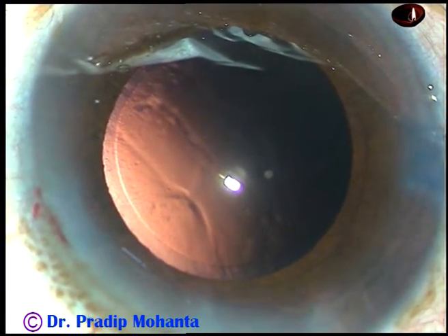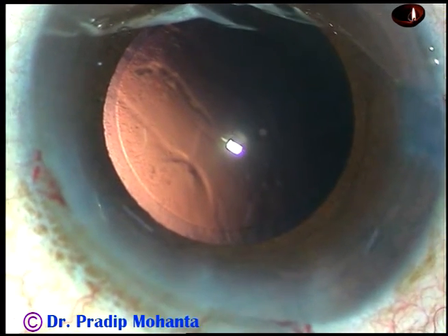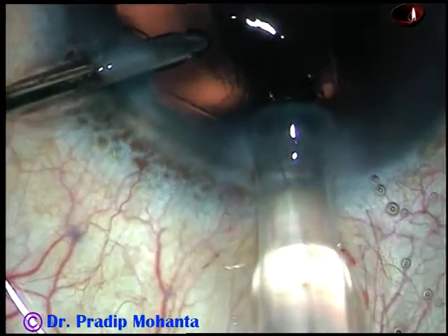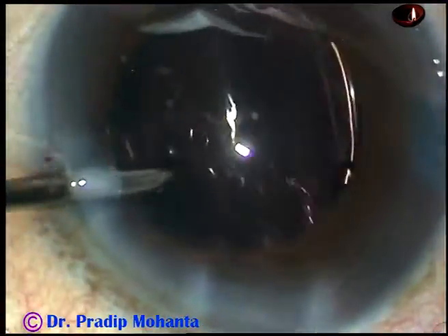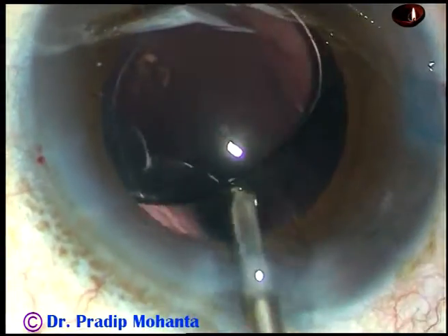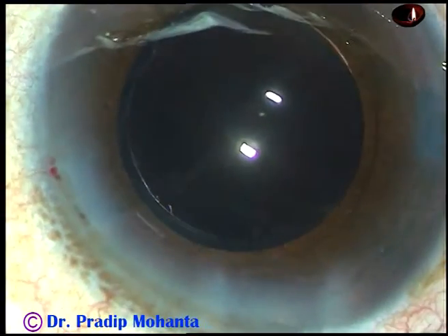And now in this case we have selected a hydrophilic acrylic intraocular lens because the patient belongs to a poor socioeconomic group. Here is the lens. And now the lens is dialed by the irrigating probe itself. Whatever viscoelastic was there in the lumen of the cartridge is irrigated out.